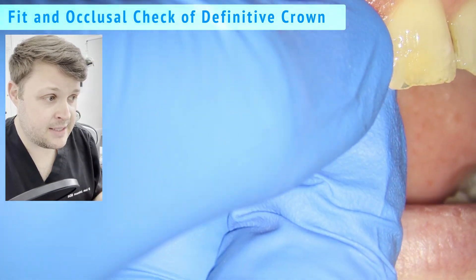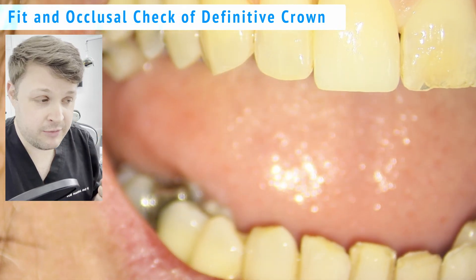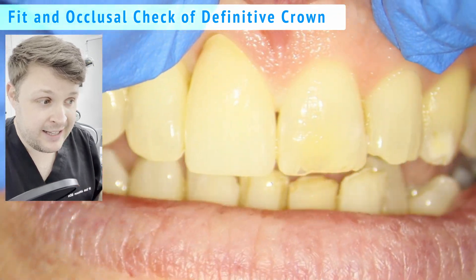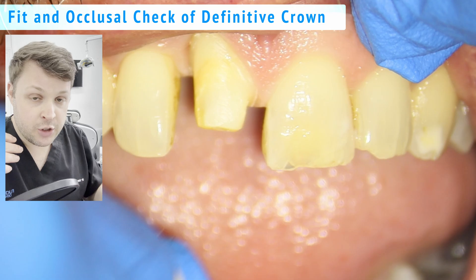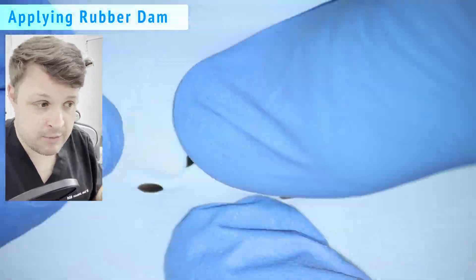Here I am placing the crown on the tooth. What I'm looking for is the color, the shape, and the fit. I've edited the video, but I did ask the patient to bite down and checked the occlusion — it's all fine, no problems. So we've removed the crown and now I'm moving on.